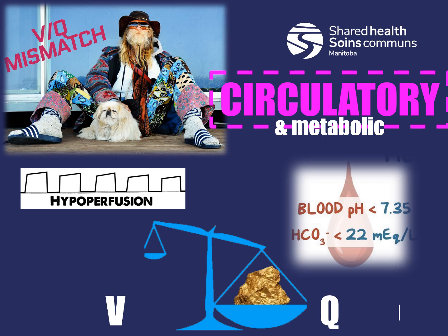Metabolic acidosis. There's fluctuation in the end tidal CO2 from the bicarbonate levels changing and their effects on the CO2 production. So you would see values of less than 30 for end tidal values.